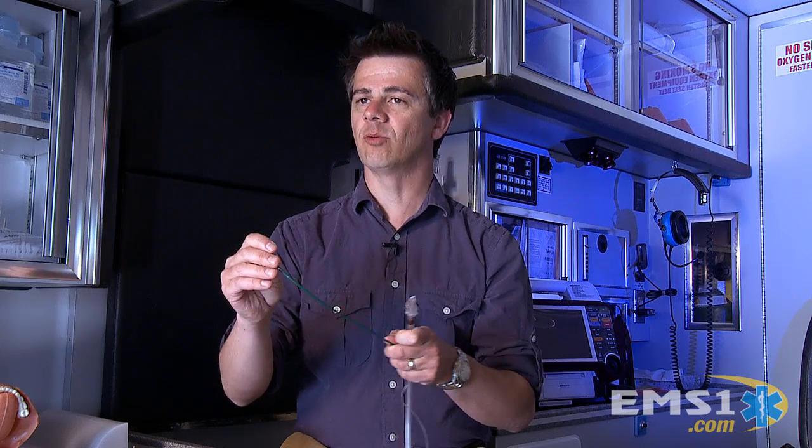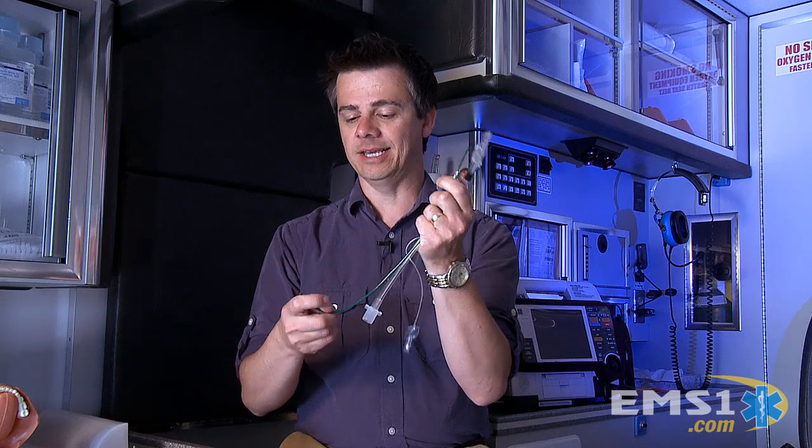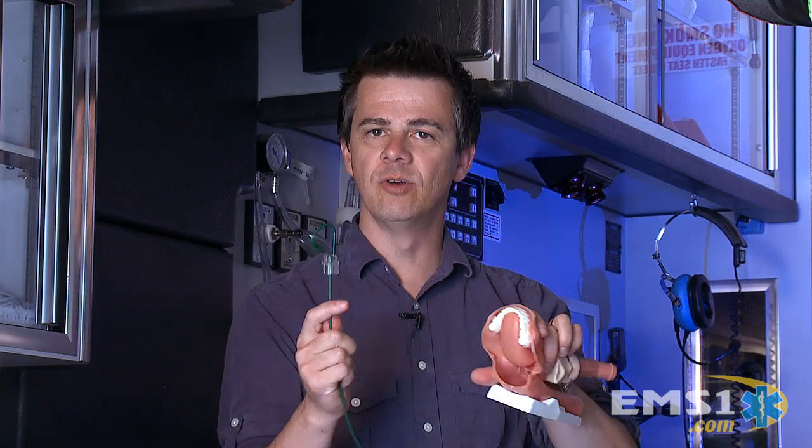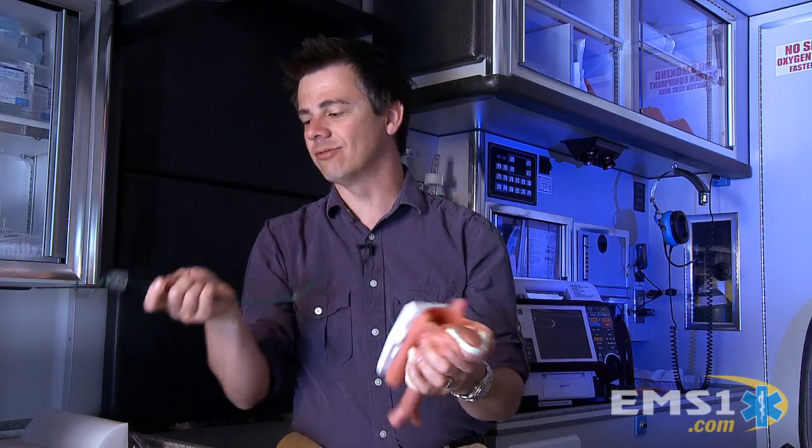Oral tracheal intubation is the gold standard in airway control. Now for many years, if you're like me, I've used the stylet and pretty much the only thing we could ever use it for was to mold it and bend it. I love the hockey stick maneuver — just take that and use it as you're moving in and trying to find the cords. That's really all it's ever been good for.